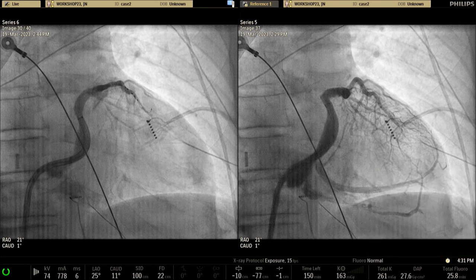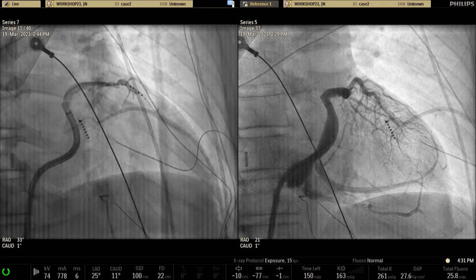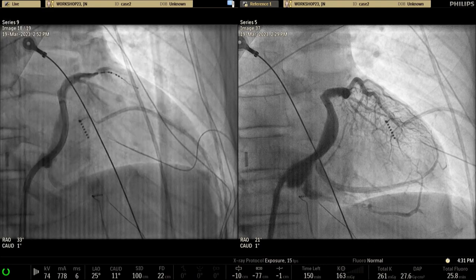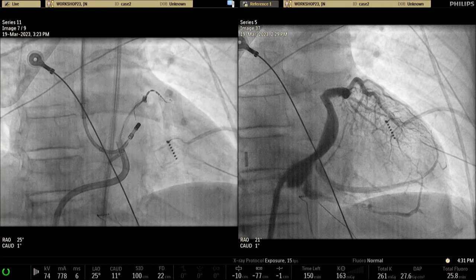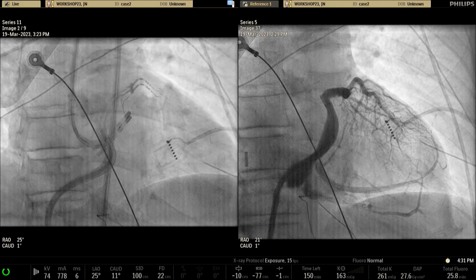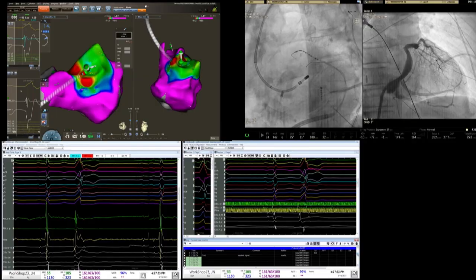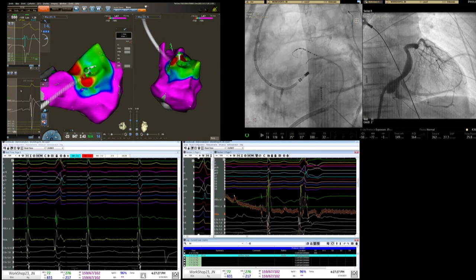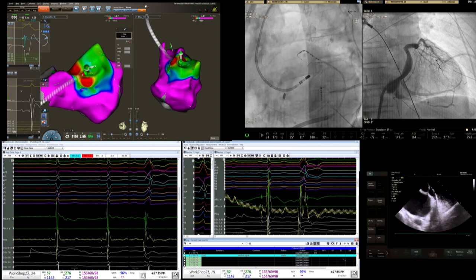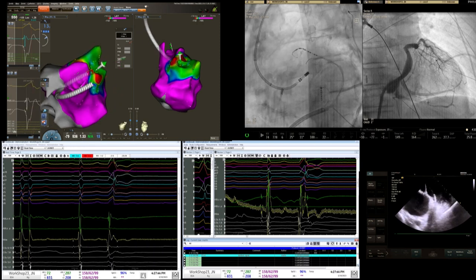We found a very big septal branch but it's very distal and the signal is late - no good signal. We kept looking and thought the best would be a very basal annular branch - that's where we put things now. In the live view there are three catheters: a mapping catheter in the AIV and great cardiac vein, a vision wire in the LV annular branch, and an ablation catheter placed opposite to the closest side to the vision wire.